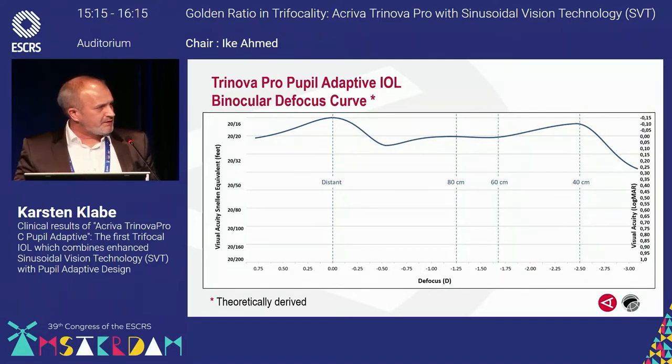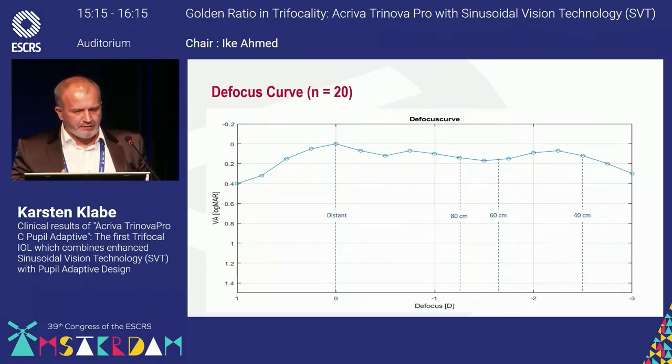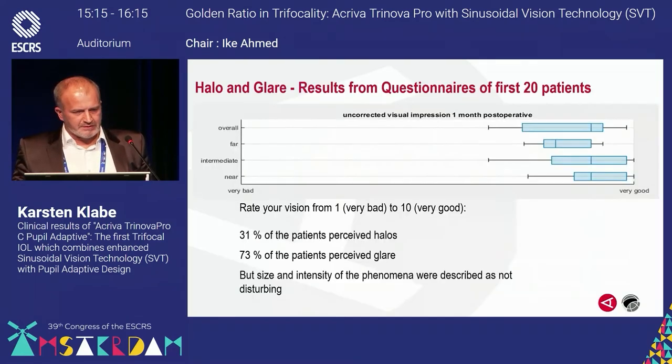So we've seen this slide already. That is a theoretically derived defocus curve. But if you compare it to the now measured defocus curve of the 20 patients, it's nearly the same. It fits very, very well. And we have good results, excellent results in visual acuity at all distances.